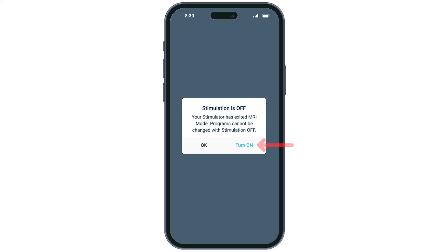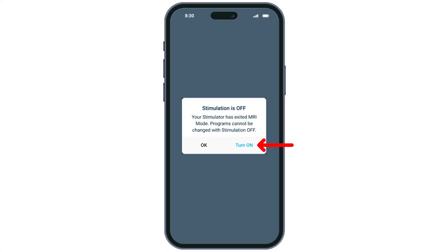To turn your device back on, tap the turn on icon. You have now successfully exited MRI mode and turned your program settings back on.